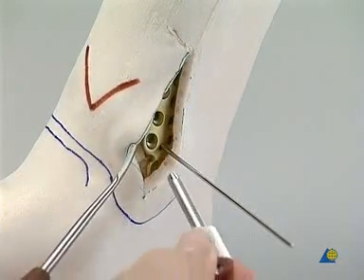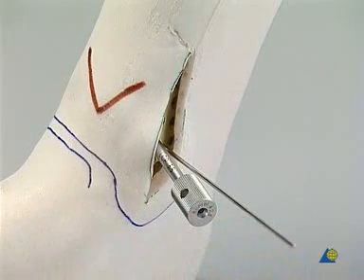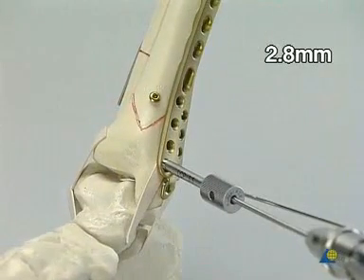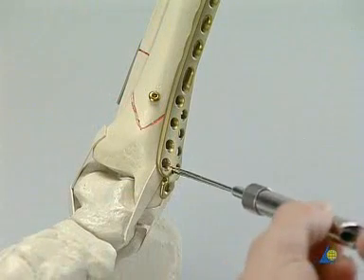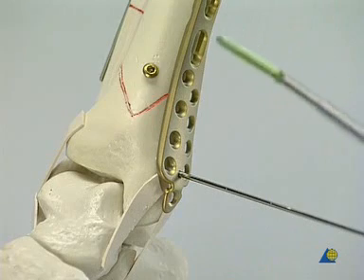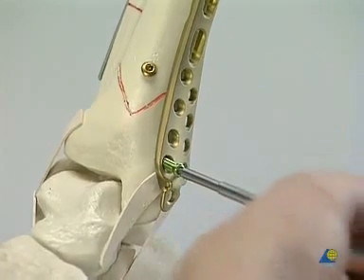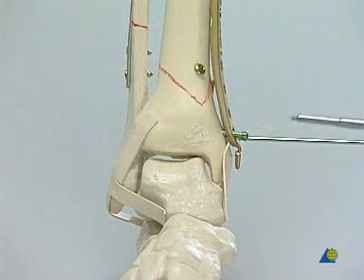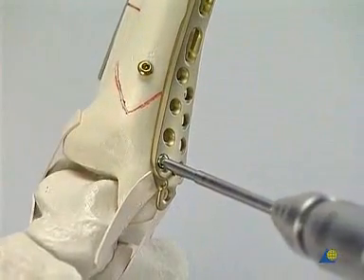The bending pin is removed. The threaded LCP drill guide is screwed into the selected plate hole gently and tightened. It helps to guide the screw and prevents the locking head from jamming. Due to the larger core diameter of the locking head screws, a 2.8 mm drill bit is used. The drill guide is removed and the depth is measured. A 3.5 mm green self-tapping locking head screw is inserted, first with the power drive but not driven fully home. The last few turns have to be done by hand with the torque-limiting screwdriver. A short click signals that the screw has reached its correct position.